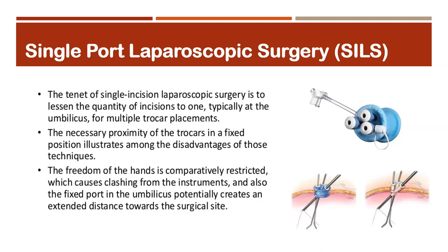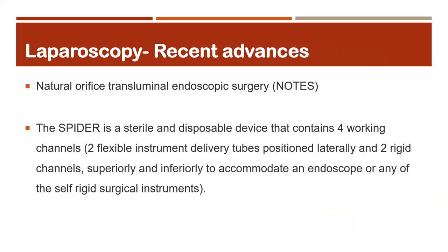But it needs other specific instruments for performing the operative procedure with SILS. And it is just like shirshasana. If we can perform anything in a normal fashion, why is there a need for shirshasana? So many surgeons discarded this procedure, single-port surgery, because the working area is very limited with a single port, and the instruments are also different. So this procedure is not very popular in the present scenario, and many surgeons have discarded the use of single-port laparoscopic surgery.